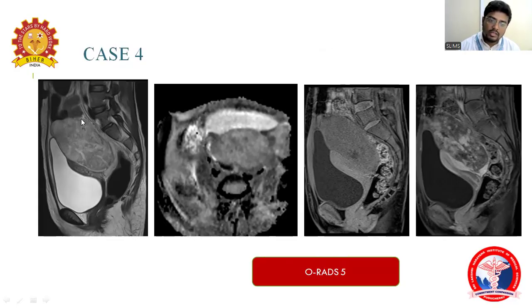And this came out to be a granulosa cell tumor in a postmenopausal woman. This patient presented with postmenopausal bleed.